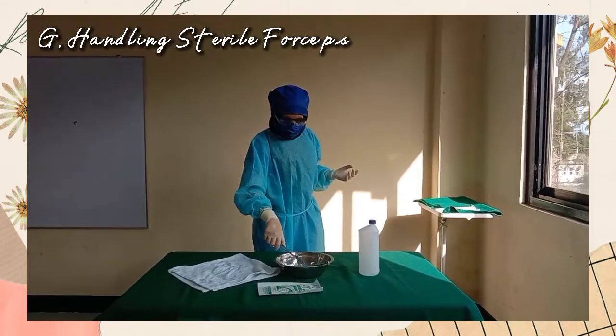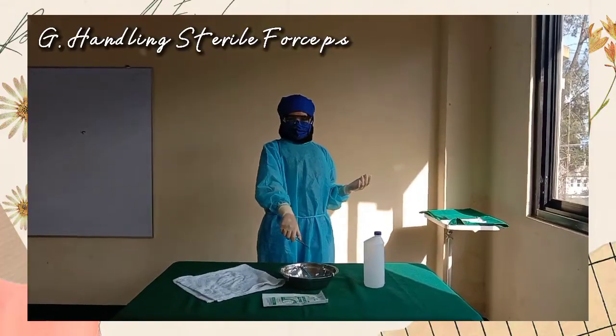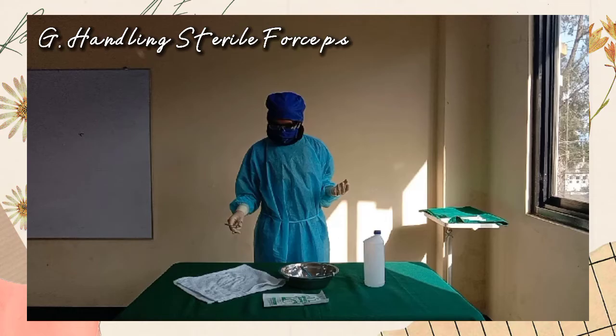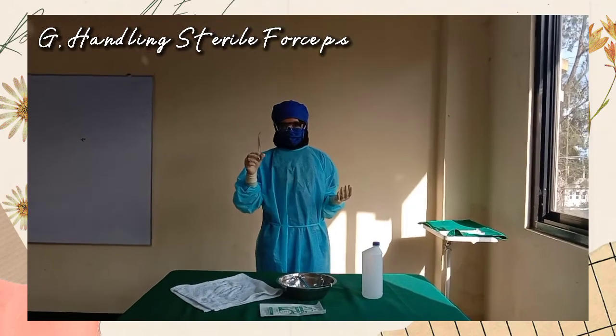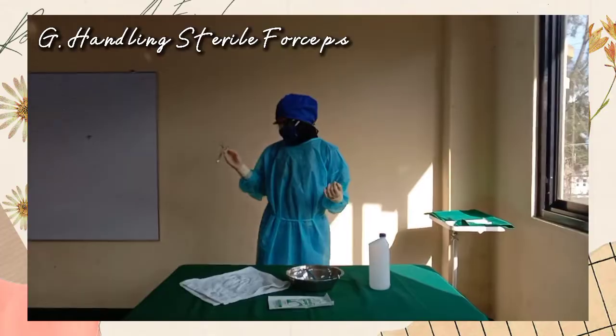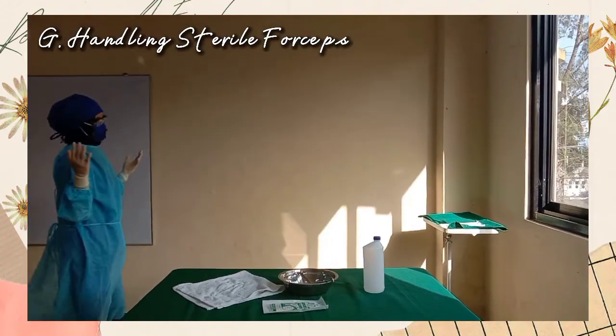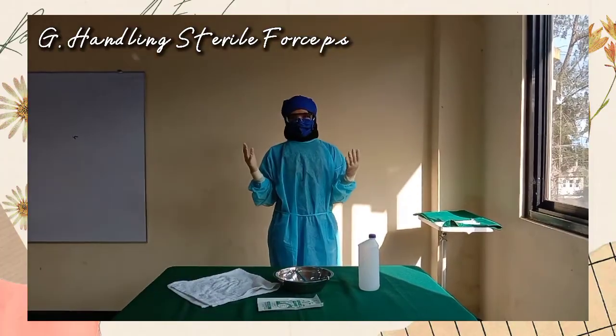Deposit a sterile item on a sterile field without permitting moisture from the forceps to touch the sterile field. Barrier drapes prevent a sterile field from becoming unsterile when the drape becomes wet. Discard disposable forceps after use, or send reusable forceps for repacking and sterilization or immersing them in a solution, to maintain sterility of forceps and equipment.